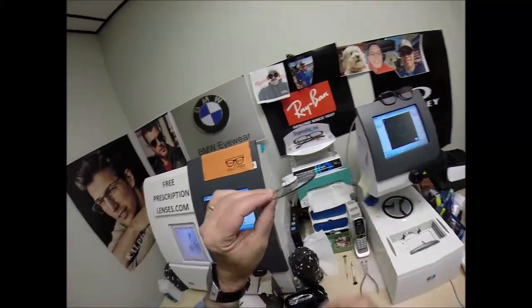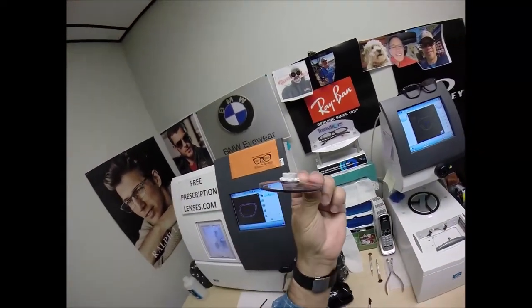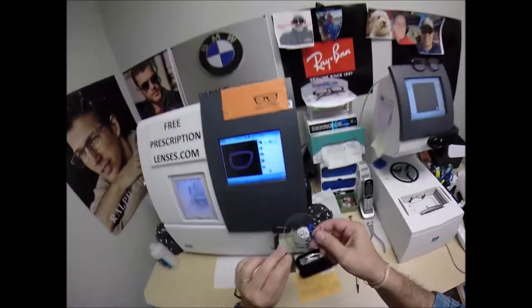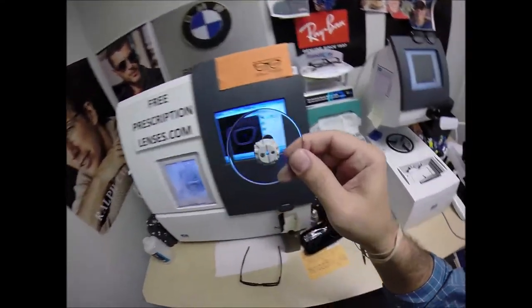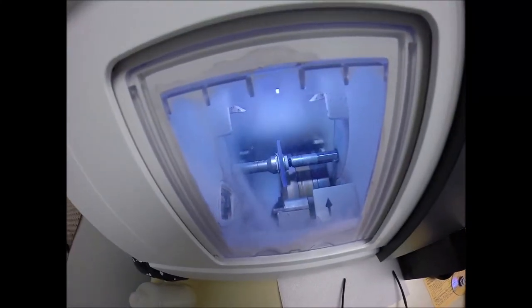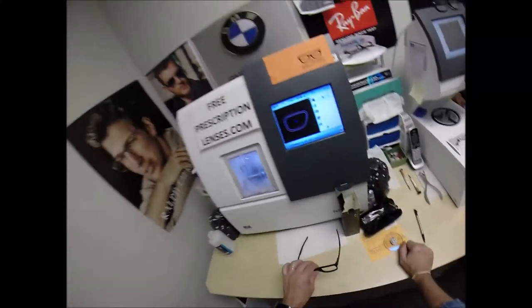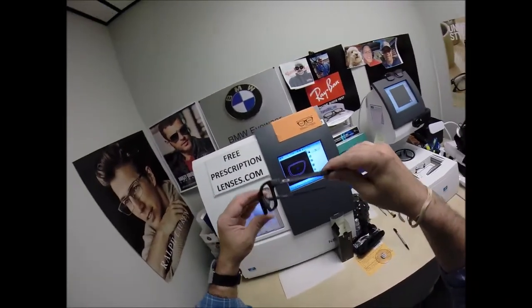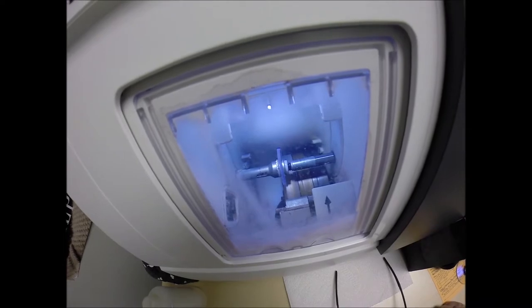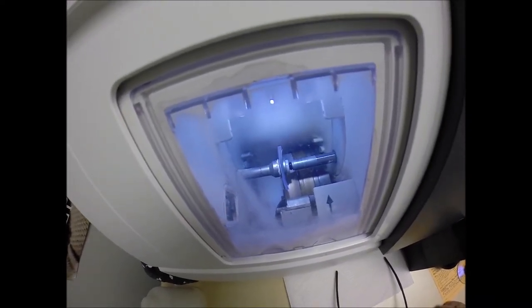So, as I mentioned, your lenses are made out of polycarbonate. Polycarb is 40% thinner and lighter than regular plastic. They're virtually unbreakable. These are high-impact, ballistics-grade lenses, the same lens material that our soldiers wear overseas in combat zones to protect their eyes from shrapnel and from flying debris in their Oakleys. It's also the same lens material that OSHA requires for factory workers to wear on factory floors, mechanics, landscapers, any of that to protect their eyes from hazardous conditions.